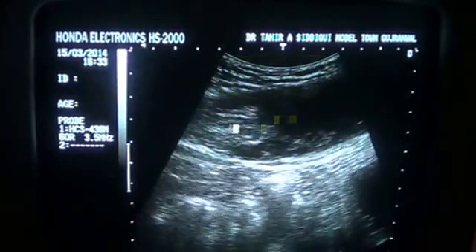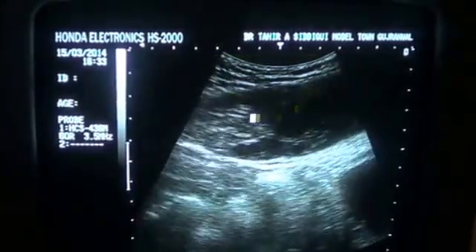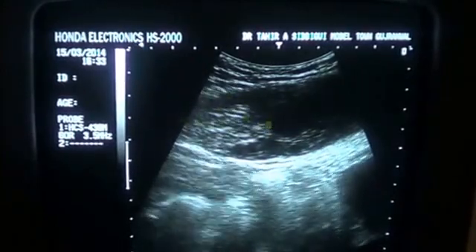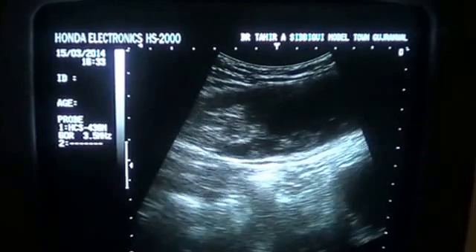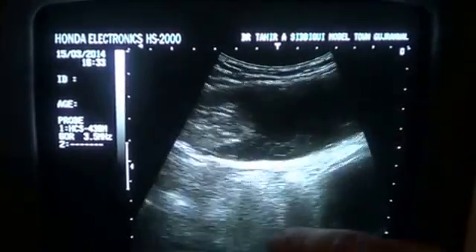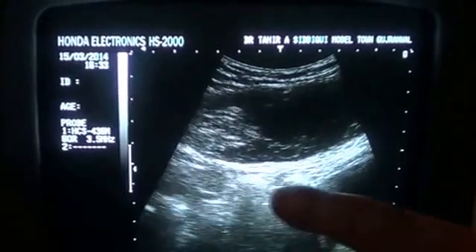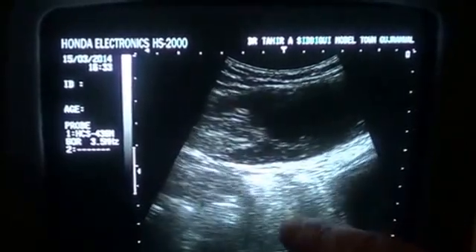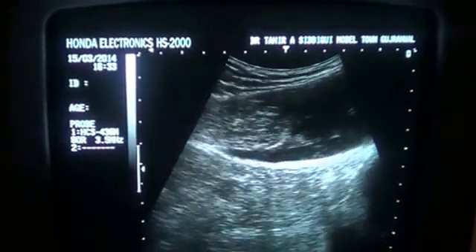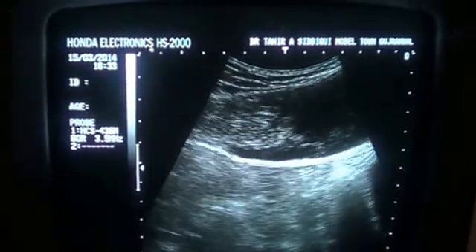Whereas there is no movement in this fluid pocket and the echogenic material contained in it. You will see no movement in the subcutaneous area. However, you will see movement of bowels posterior to the peritoneal line. So it's not an intraperitoneal lesion.